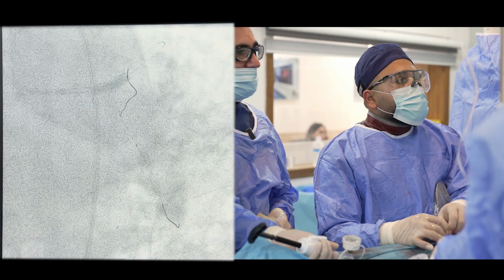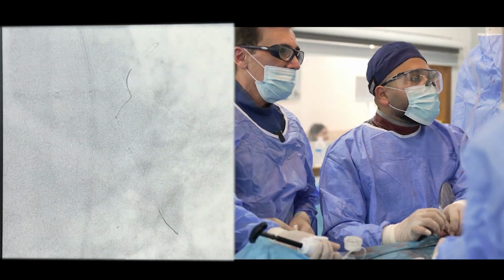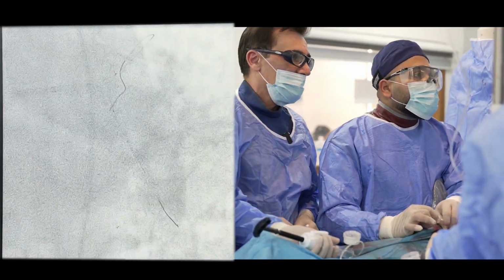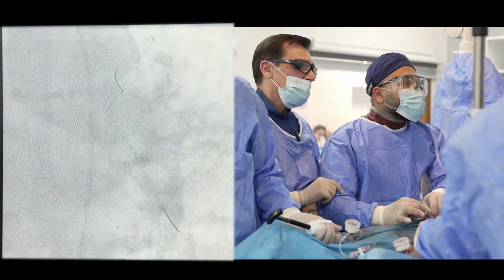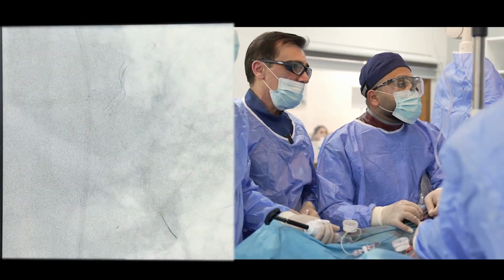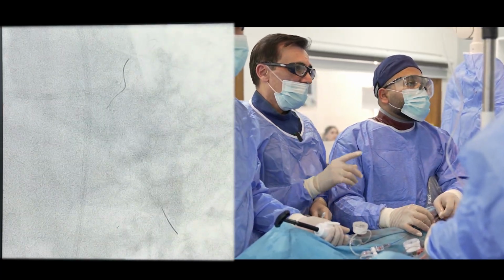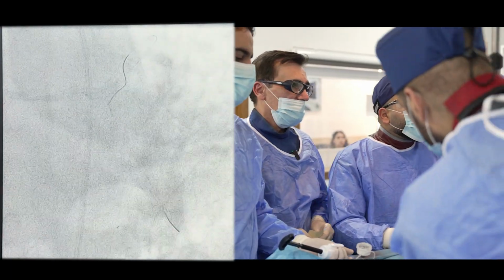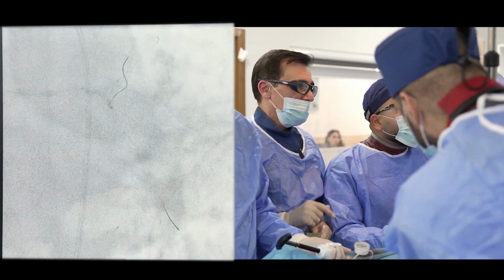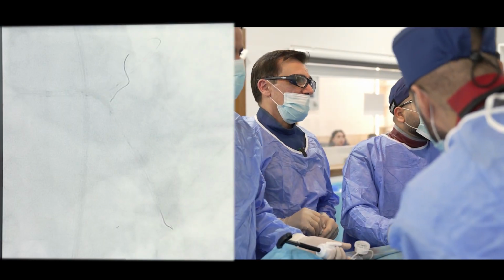Okay, now let's inflate the ostium of the circ. Not now, wait. Pull back the balloon. No, not this one. Keep it here. Keep the left main. Just pull back the circ balloon. Yes, more. Yeah, that's it. Go. 12. 20. So high pressure inflation for the circ ostium. Off.